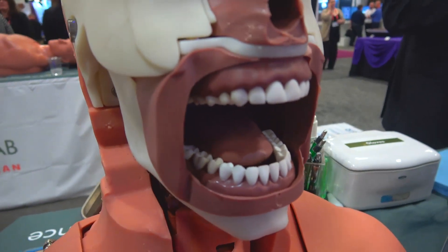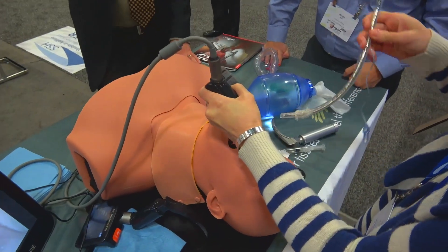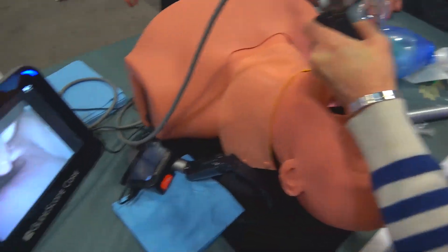Hi, my name is Steven Hertz and I'm director of sales from Simulab Corporation. We're here at IMSH 2019 San Antonio. What we're releasing today is our Airway Man trainer, and our concept with the Airway Man trainer is that we've listened to all of our customers and what they see out there for the airway training market.